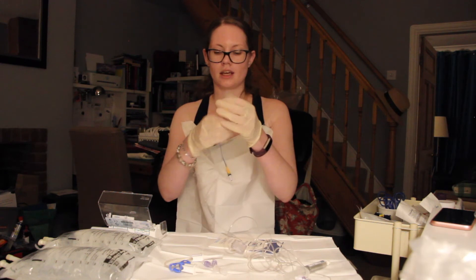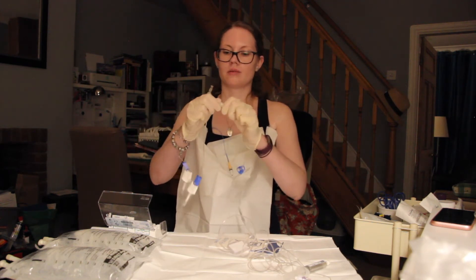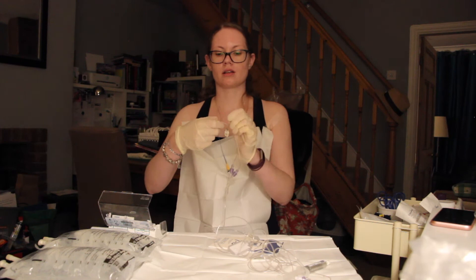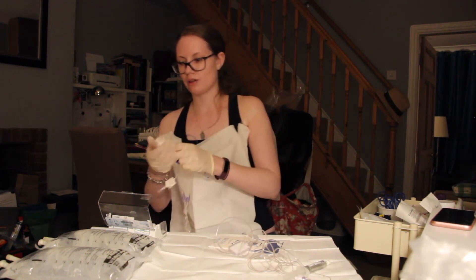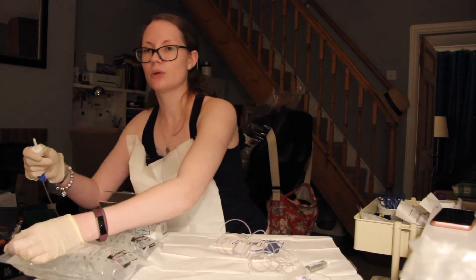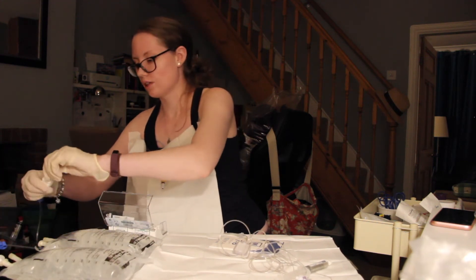So this end here connects to this end here. There are little caps — I don't know if you can see — which I'm just going to remove. And then without touching either end, just screw it on. You then close the little blue clamps on the line. And we're going to spike the bags — take the cover off the spike, and then the little port on the end of the bag. Just going to stick the spike in and push until it goes all the way. And we're going to do that for the other spike as well.